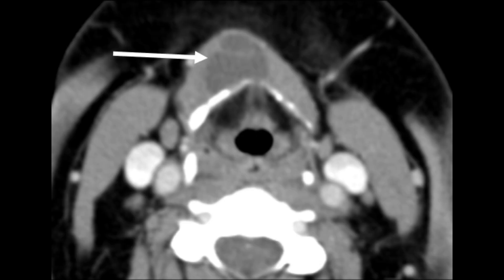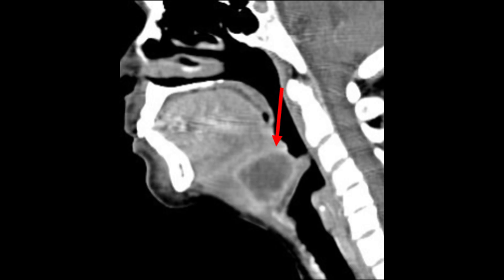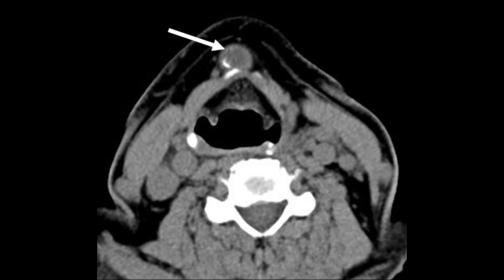Thyroglossal duct cysts may also appear paramedian, especially when trapped between strap muscles, but they are never truly lateral. If you encounter a cystic lesion away from the midline, consider an alternative diagnosis. Typically, the cyst wall shows no enhancement or only minimal enhancement after contrast. When infected, enhancement becomes more pronounced. If you see internal solid nodules or calcifications, consider the possibility of malignant transformation.